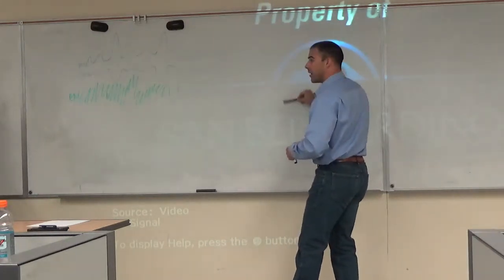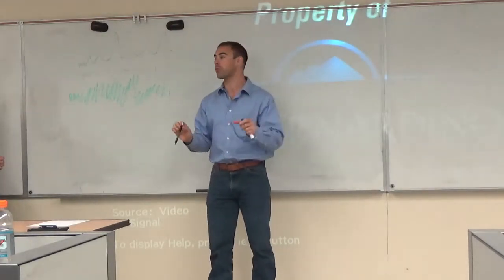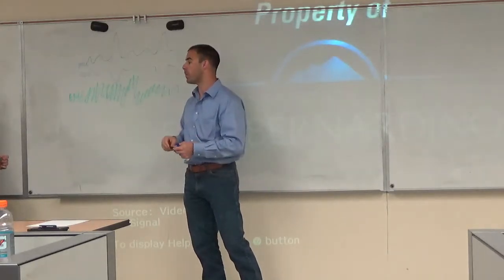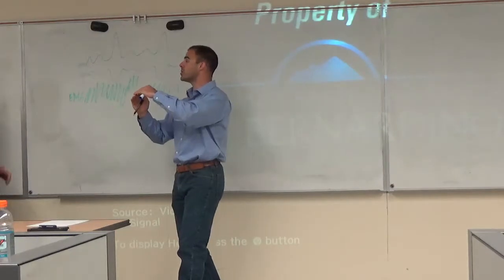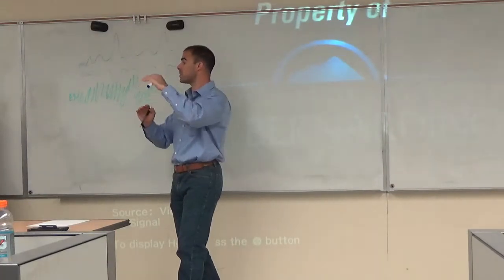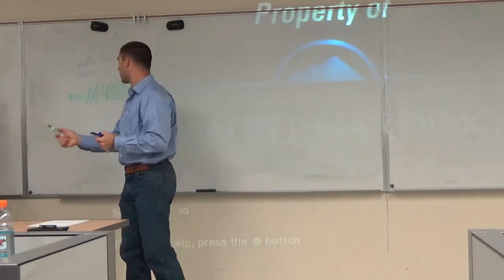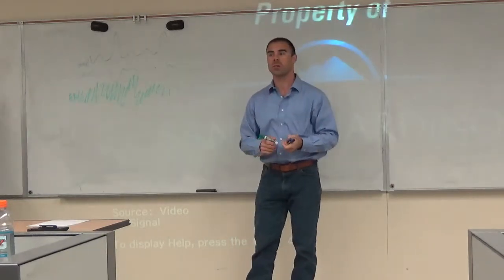So tension is not necessarily indicated by low frequencies. It would certainly be higher frequencies, but when we would see greater degrees of it, we would probably see it in the amplitude, not the frequency changes. Good job. We're just going over the Yep. Good job. Okay, so what are some other ones?